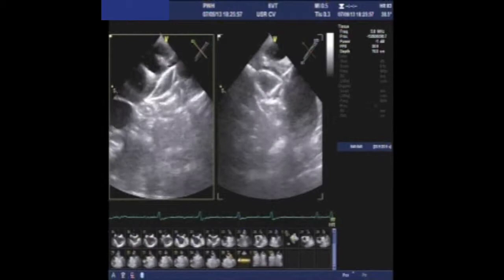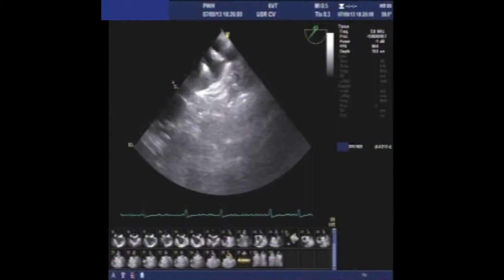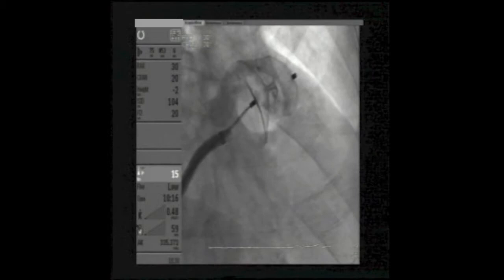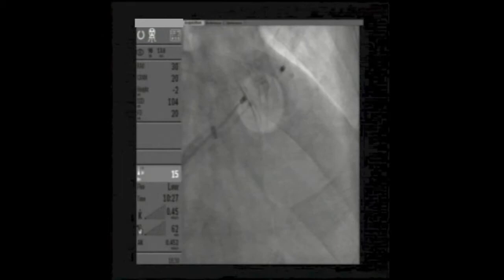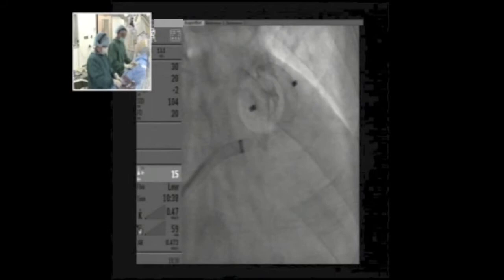We are running short on time. Stability testing is good — no leakage on echo. A quick injection confirms there is no more flow in the appendage — very good result. We proceed to release the device with counter-clockwise rotation of the cable, as is standard for the plug device — four or five turns. We are not expecting much movement of the device after release.